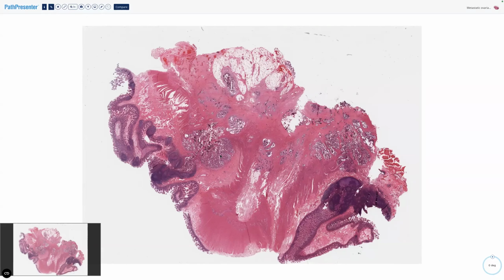So high-grade serous carcinomas, as I've mentioned, all have a p53 mutation, which means they're very genetically unstable. And like the ones in the uterus, they appear wild looking, really pleomorphic. Now we're doing more molecular. There's a little trick I want you to know. We used to be able to diagnose, well, we still can diagnose serous carcinoma on any old little bit of tissue.